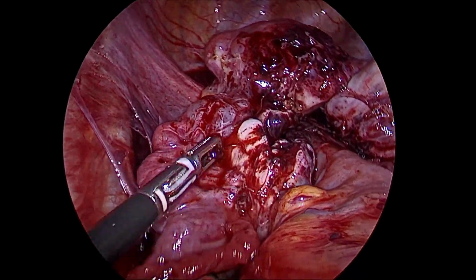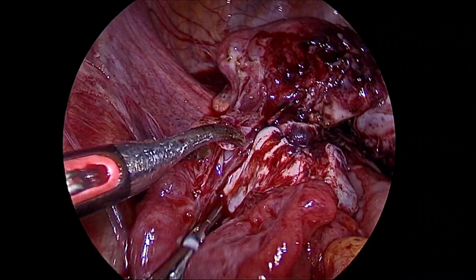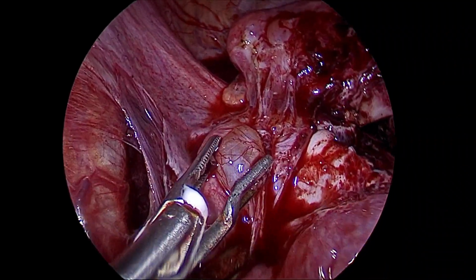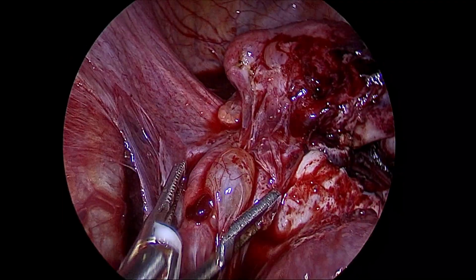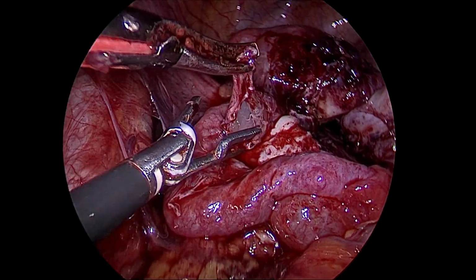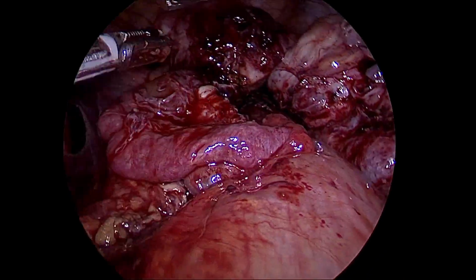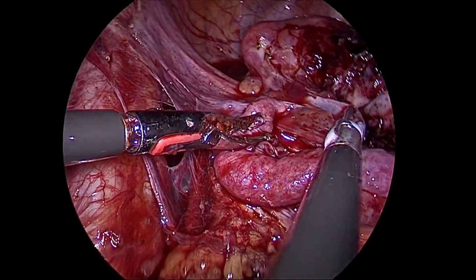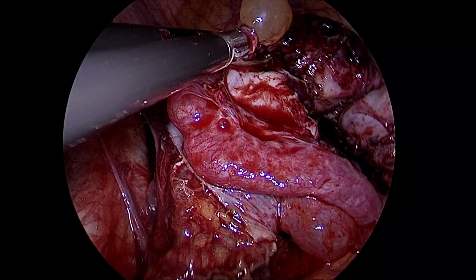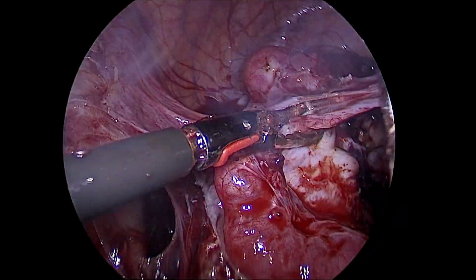Then we made the tubo-ovarian anatomy normal. As I mentioned, she is for fertility. And after doing that with simple bipolar shearers and blunt and sharp dissection, we check for the patency of the fallopian tubes. Here, as you can see, there are again small peritoneal inclusion cysts. These are very slippery. You have to hold them well and then just cut it off with the bipolar shearers.